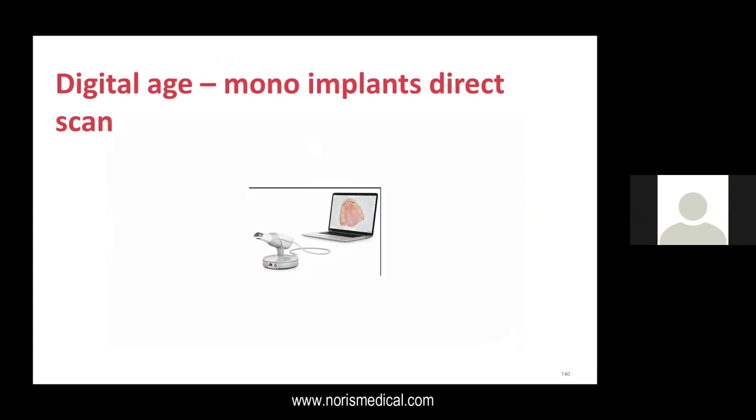We reached actually the last part of the lecture, and this is the digital age of the implants. It's actually a thing that I really, really love, all the digital age. Those of you who will join me to further lectures will see how I work with CAD/CAM. I do amazing things with it. Here, I'm using the CAD/CAM without any transfers, just scanning the implants. The implants are very friendly, especially to the 3Shape scanner, and I do it very, very easily.